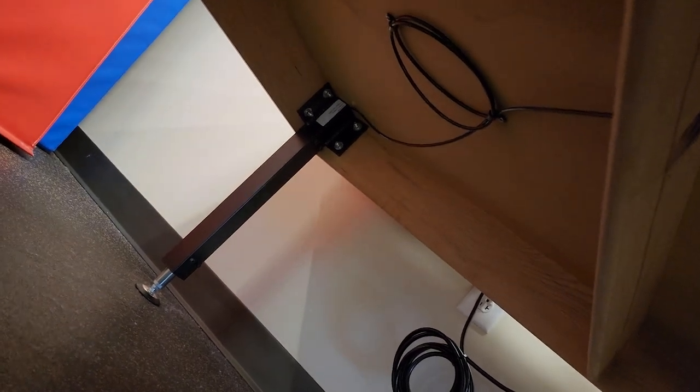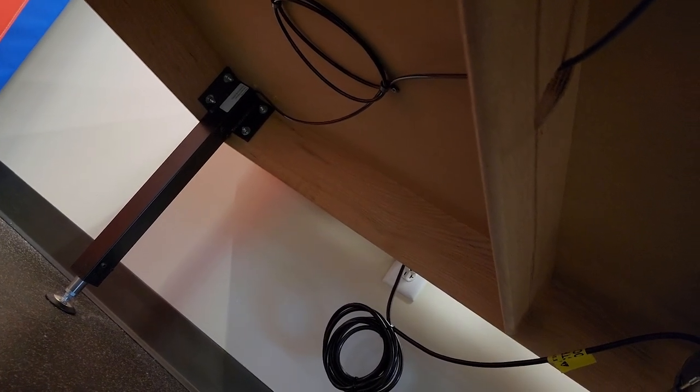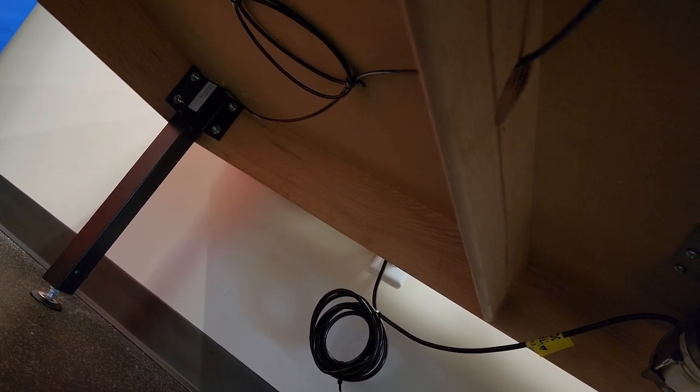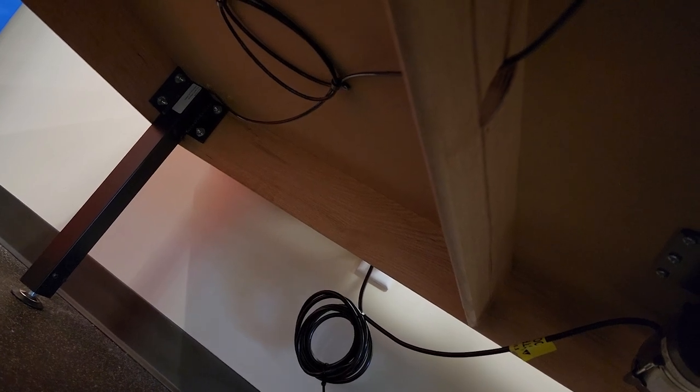Hey, Mike, can you go ahead and hit the up and down, please? Okay, you can see it's going up very slowly. Okay, and back down. Tell you what, let's take it all the way down, because when I undo these hydraulic lines, it would come crashing down on me.